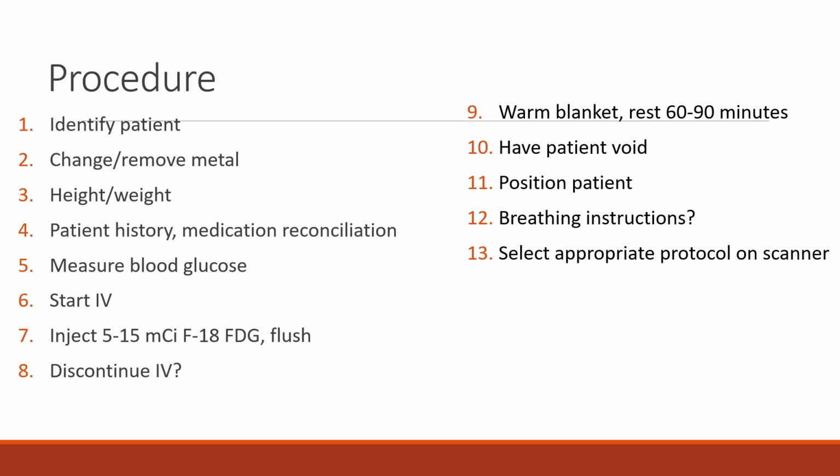If they have any, or you want to give them breathing instructions, if there are any, typically that's just done when you're doing a CT with it. But you want to tell them, even if you don't have any specific breathing instructions for the PET scan, you want to make a point to tell the patient they can breathe normally.